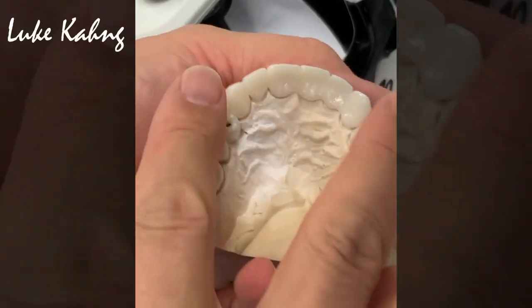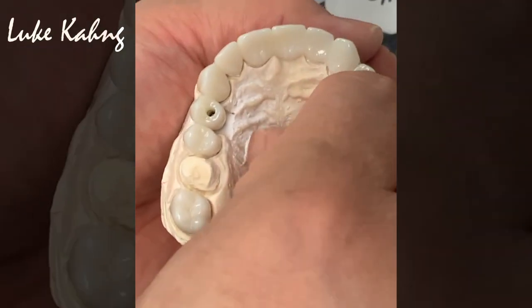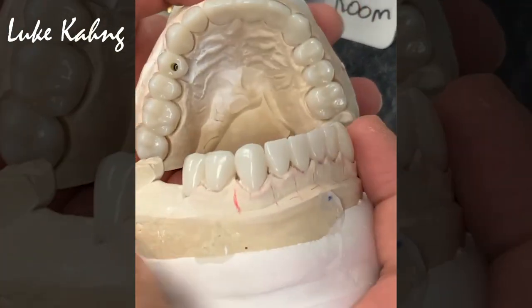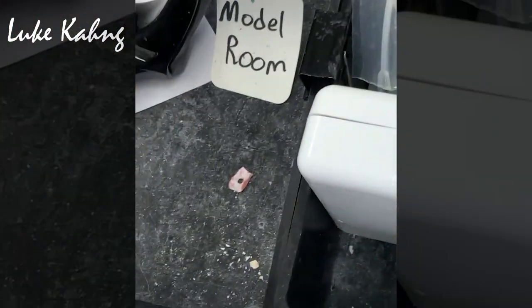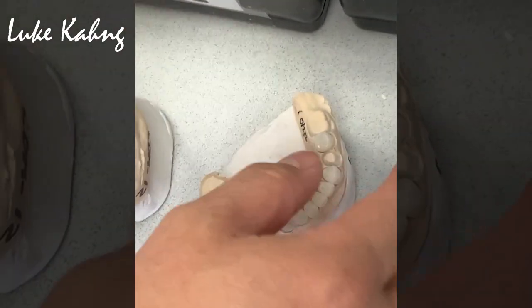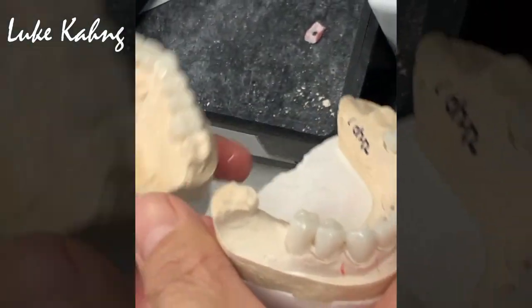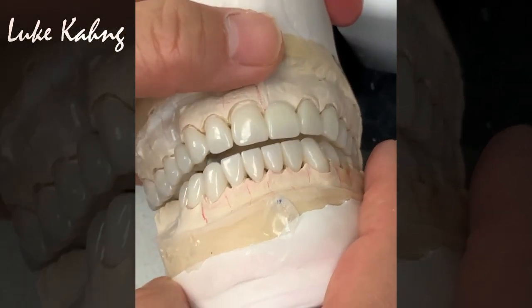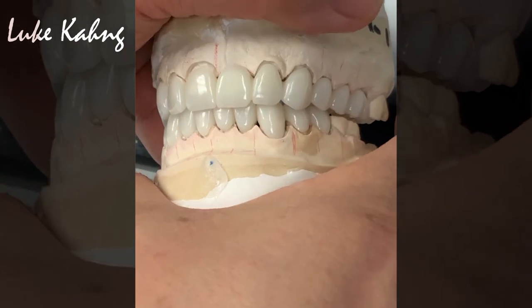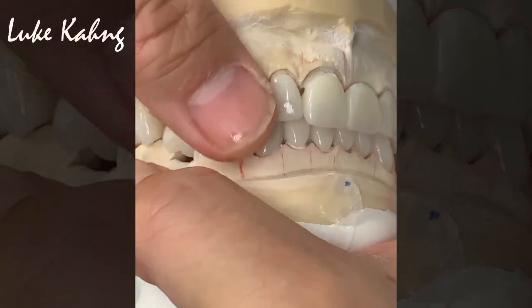So basically we follow the occlusion, and from the lower, okay, so now we're trying to get the occlusion back. Okay, so you can get it like this. So now the piece of art case is finished.